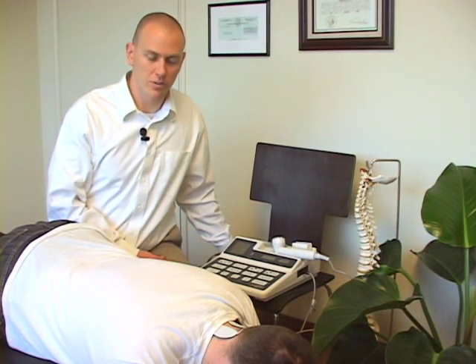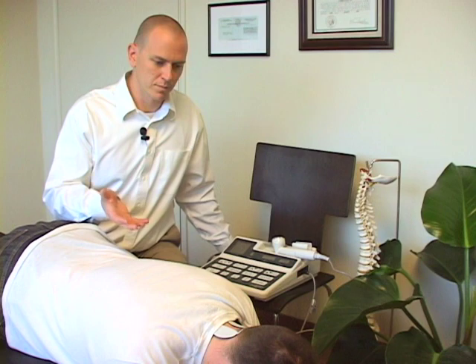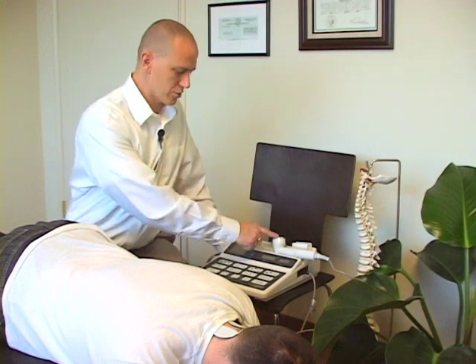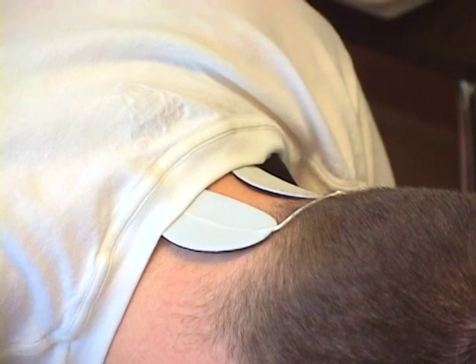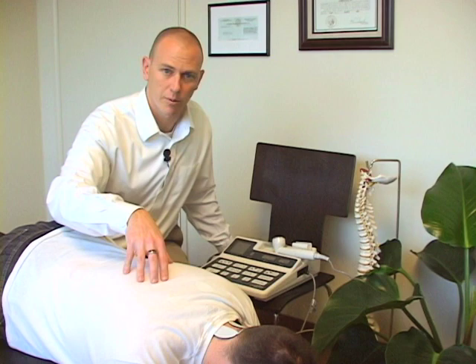After an adjustment in many chiropractic offices, adjunct therapies are done as well to complement the effects of an adjustment. There are many different types of adjunct therapies. Today we're demonstrating on this unit EMS, or electrical muscle stimulation. There's also an ultrasound head here that we could typically use. For the areas of the cervical spine or the thoracic spine, we're going to get pads set up on the areas that we need to work on.